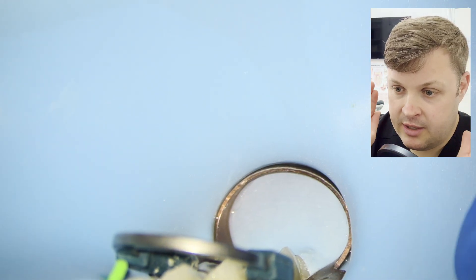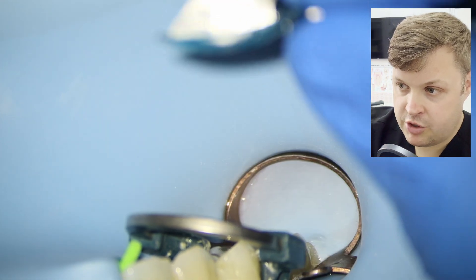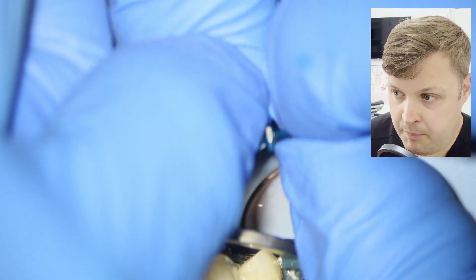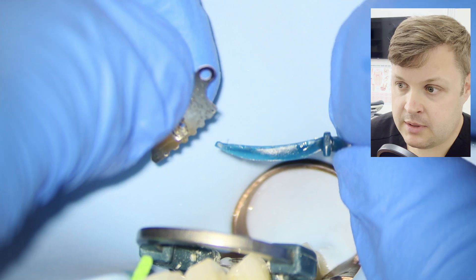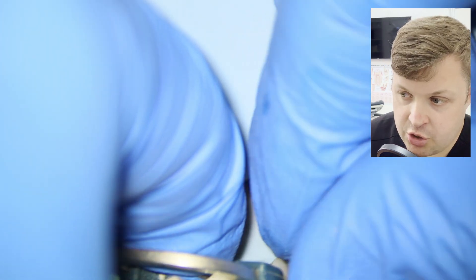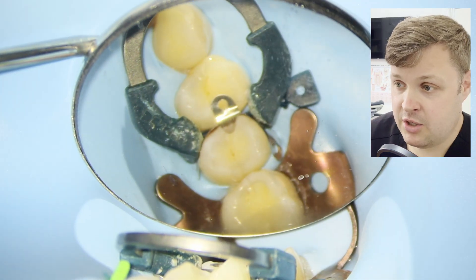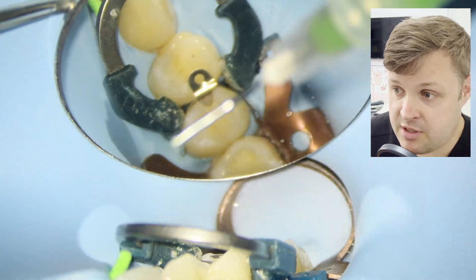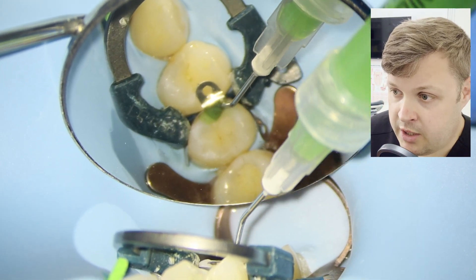A great thing about these wedge guards is they can be recycled — you can pull away the old silver protector and just use the wedge on its own, which is really good for cost effectiveness. So we're going to re-etch the cavity.